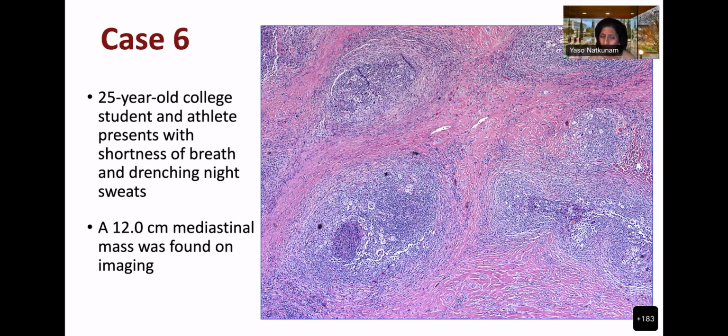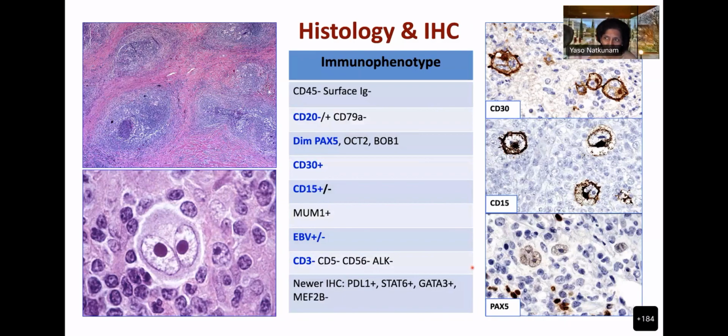It's more intense. What's the other thing you can see in Hodgkin lymphoma? This particular case doesn't show it. This is just a very typical nodular sclerosing Hodgkin, but you can see necrosis there. Yes, okay, that's actually what I was getting at. You can see granulomatous inflammation and necrosis. That's the answer I wanted to hear.